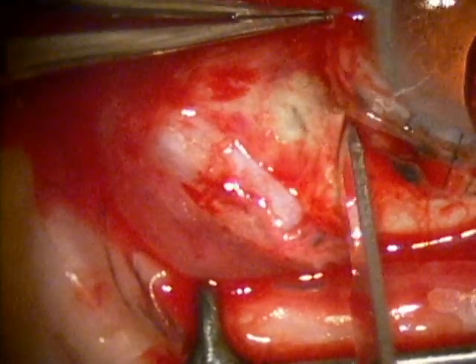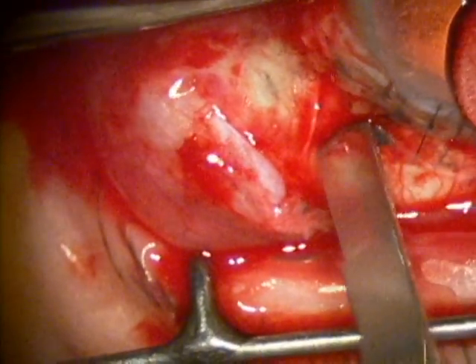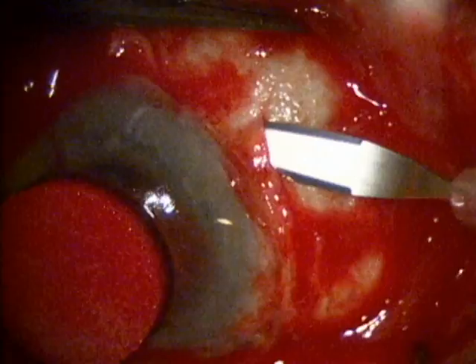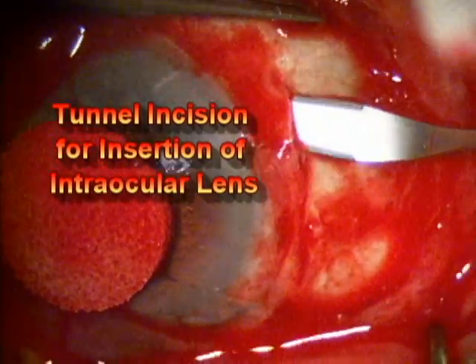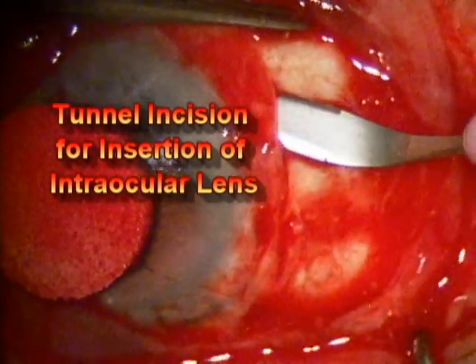This unfortunate patient had had previous cataract surgery and she fell out of bed and hit her eye on a night table and because of the trauma, she had her intraocular lens dislocated from the eye. Another surgeon did the vitrectomy to repair the ruptured globe and at the time of the surgery felt it was necessary to remove much of the iris.